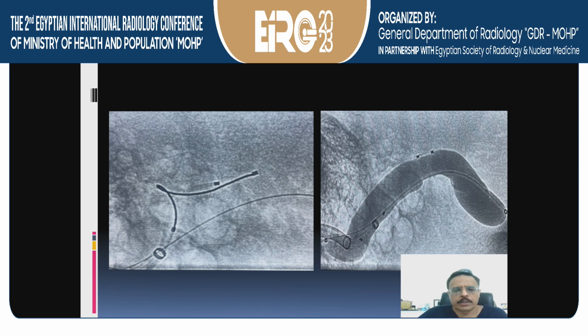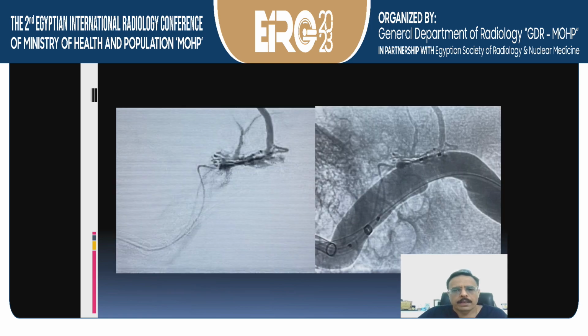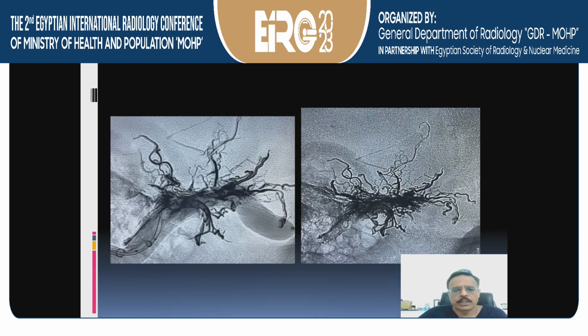Another microcatheter was placed as well, and then the balloon was inflated, with two microcatheter tips seen. So we were right at the site of the fistula. There was no margin of error here. And then this is the microcatheter injection showing the fistula in the wall of the sinus, and then we could inject all of it all around, closing the fistula completely while preserving the dural sinus.